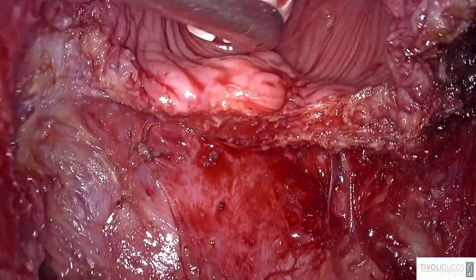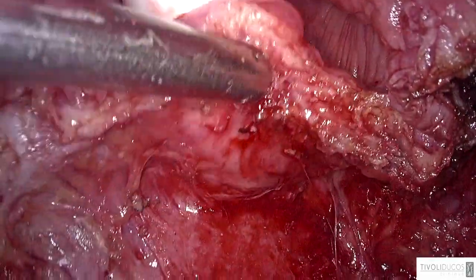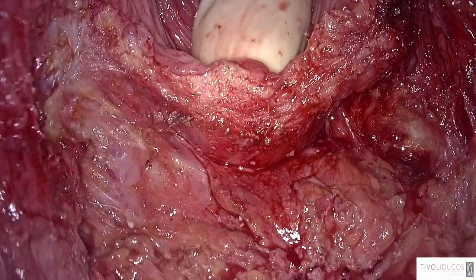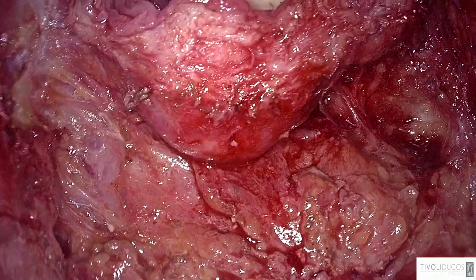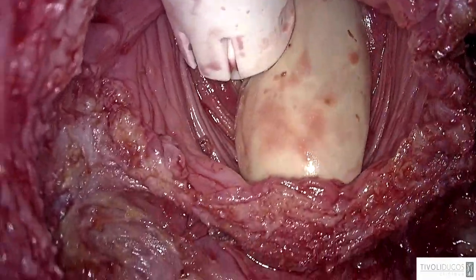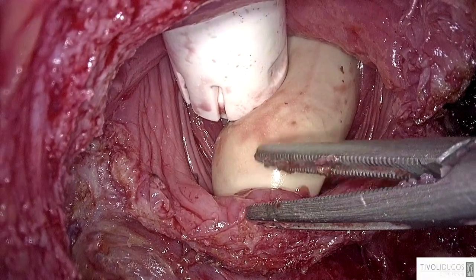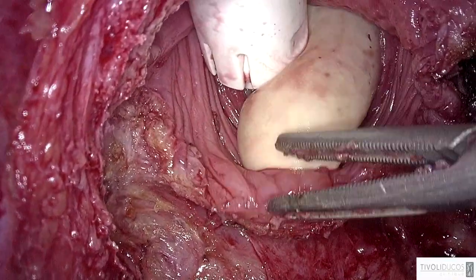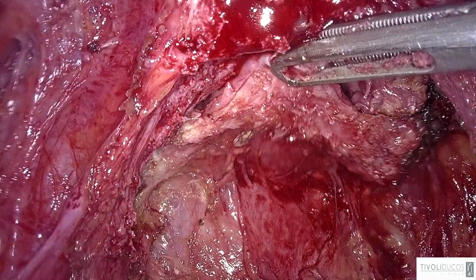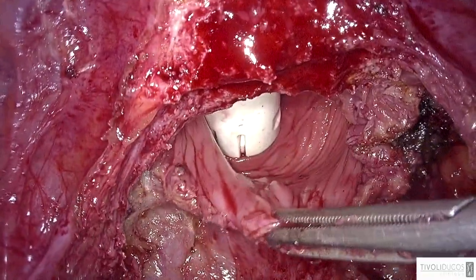The question is if here we have endometriosis or not. It's a very small cyst. If I see here, I think there is no endometriosis. I will put a finger. Very difficult to say because here, if you look, we are below the nodule. Honestly, I don't know. What do you think? Is it endometriosis or not? I think yes. It's very small, but the cyst, I think, yeah. If you take it out, no harm. In terms of the length of the vagina, I think you should take it. Thank you. I will put a 10 millimeter trocar and then I will remove it.